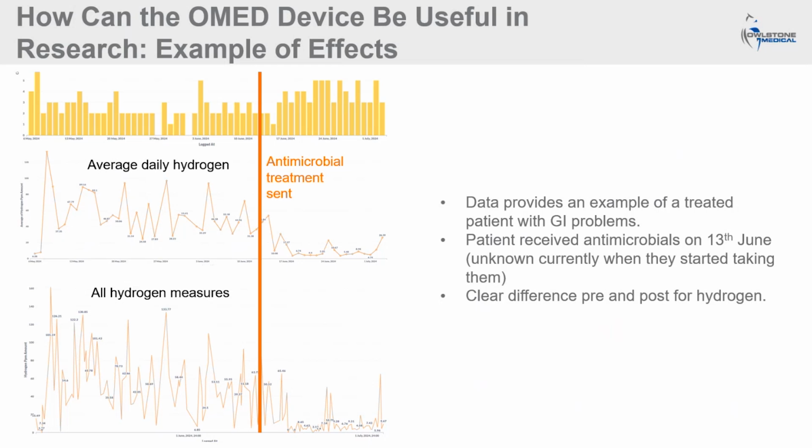So I hope that gives you a bit of context into how this kind of technology might be useful in terms of understanding the impact of different fibres on fermentation and averaging out the natural variability, and also giving you some thoughts about how you could use this technology to actually look at efficacy of, for example, a probiotic or a prebiotic or a postbiotic or whatever your intervention treatment is, giving you a better way of being able to understand in a real world way what actually is the impact of your product, and can you see something?